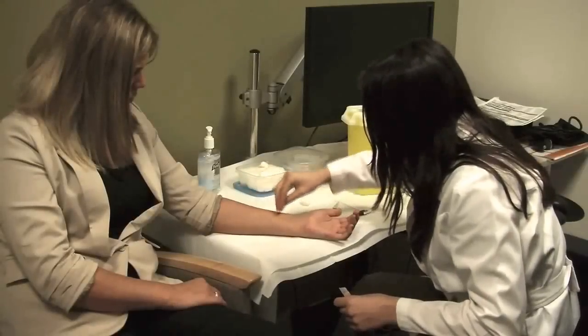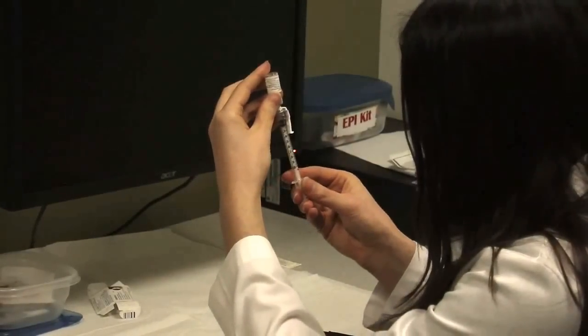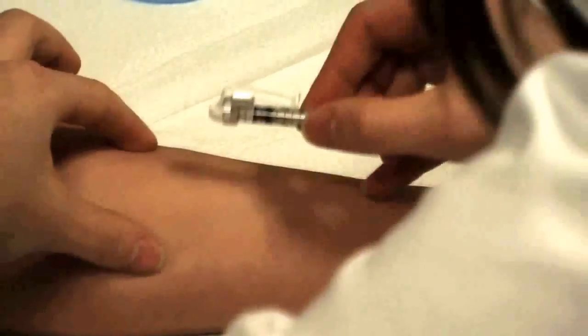Nurses at Algoma Public Health have been administering TB skin tests for decades. Here is a friendly review of proper administration of TB skin tests. The TB protocol from the Ontario Ministry of Health and Long-Term Care states that the client must be tested on the volar surface of the forearm, 4 inches below the bend of the elbow. Be sure that the bevel of the needle is facing upward and inserted at a 15 degree angle.